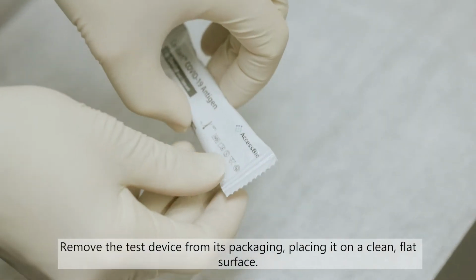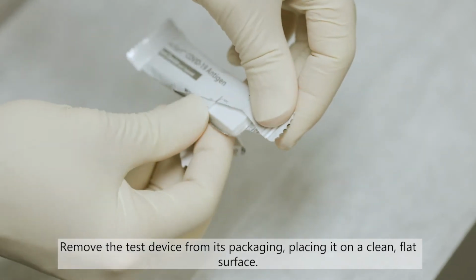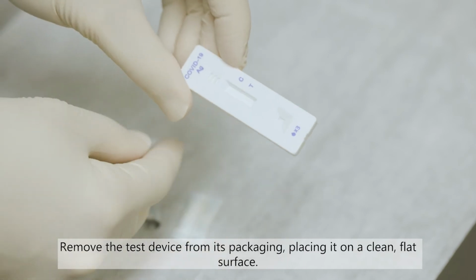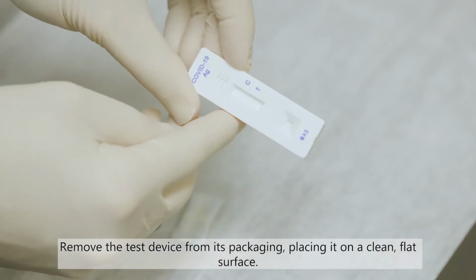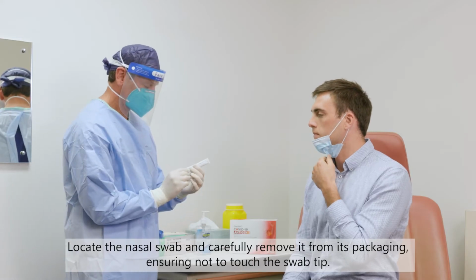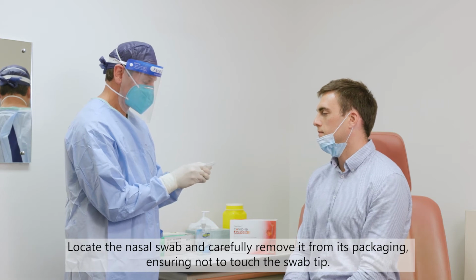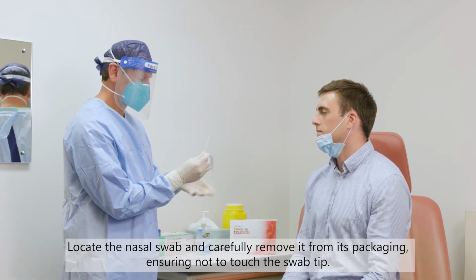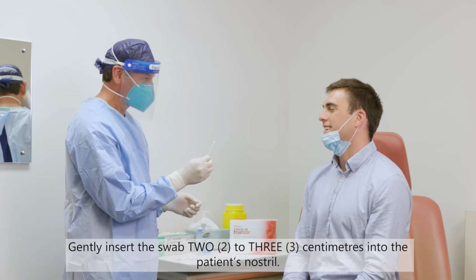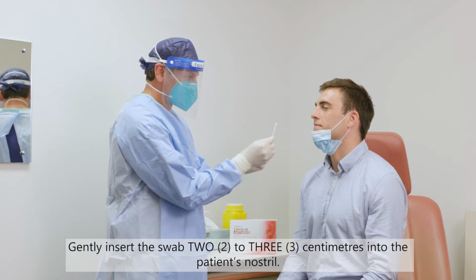Remove the test device from its packaging, placing it on a clean, flat surface. Locate the nasal swab and carefully remove it from its packaging, ensuring not to touch the swab tip. Gently insert the swab 2 to 3 centimetres into the patient's nostril.